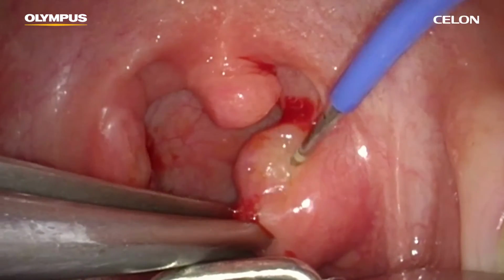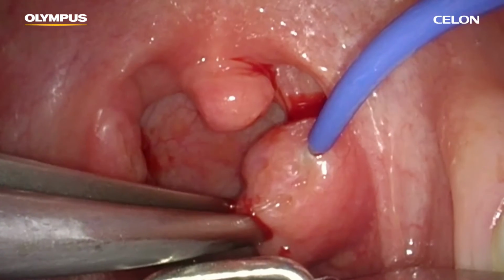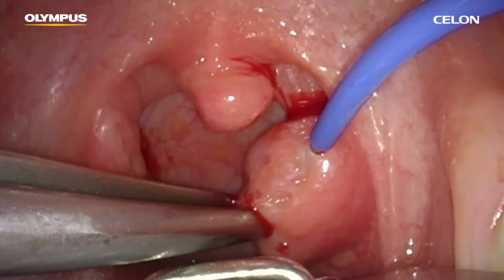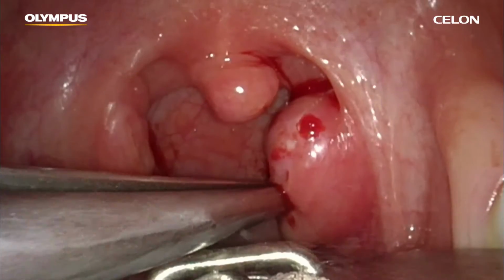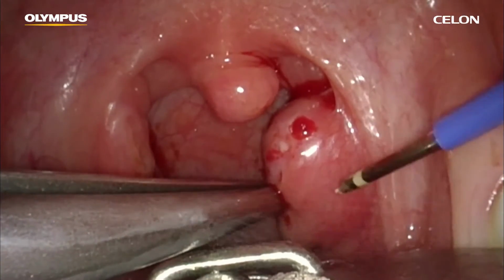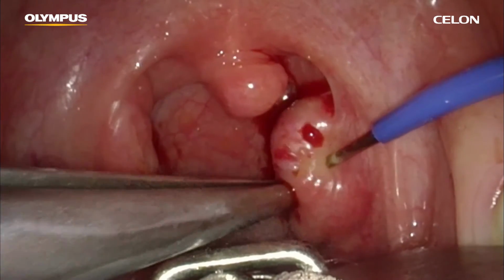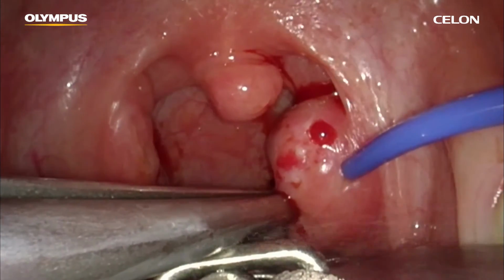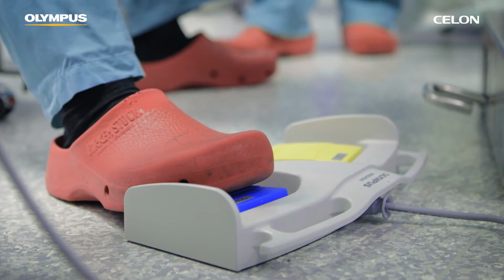Insert the applicator into the tonsils until the insulating tube of the probe touches the tissue. Take care not to penetrate the underlying tonsil capsule. Also, avoid the immediate area of the tonsil bed by pulling the tonsils away from the critical structures and toward the median plane. After positioning the probe, activate the power supply by pressing the foot switch.